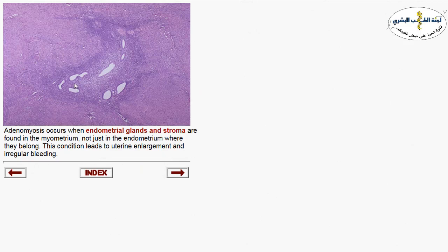Another condition affecting the uterus is adenomyosis — endometrial glands and stroma found within the myometrium. This condition leads to uterine enlargement and irregular bleeding. Within the myometrial fibers, there is a focus of endometrial glands and endometrial stroma.